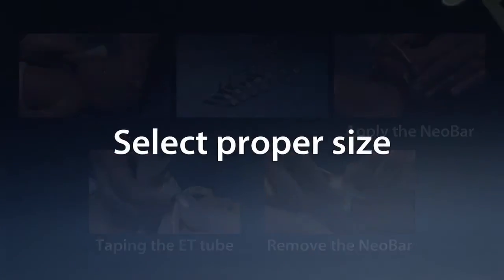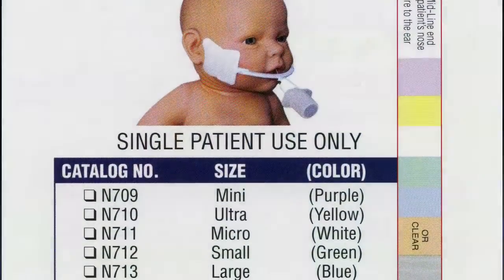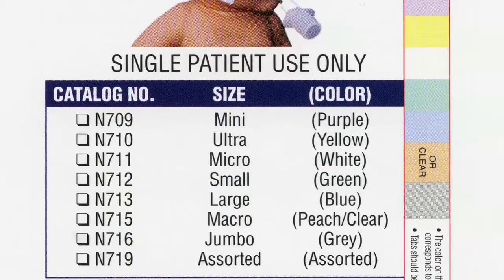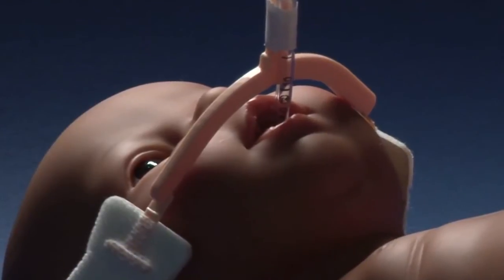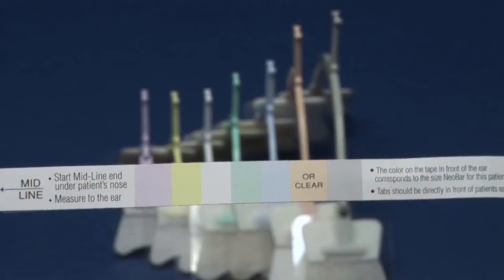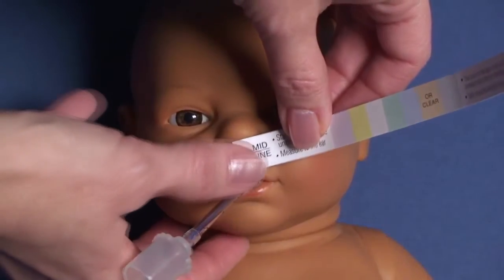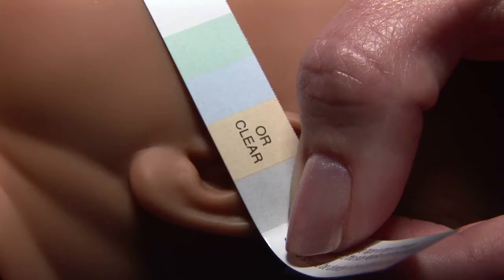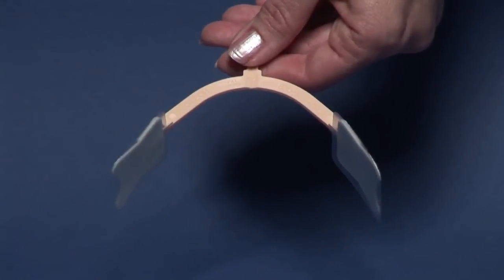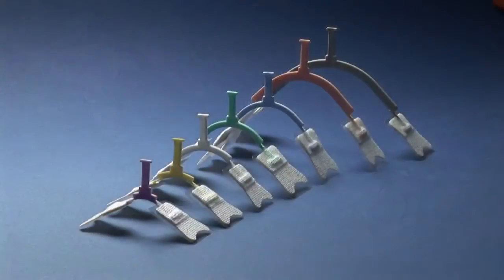Select the proper size Neobar. There are many sizes to accommodate everything from micro preemies to pediatric size patients. The measuring strips in the package are color coded to the different Neobar sizes. Place the end of the measuring strip at the midline of the nasal septum and measure the distance to the opening of the ear canal. The color that lands on the opening to the ear canal corresponds to the appropriate size Neobar. If the distance borders between two colors, use the larger size.